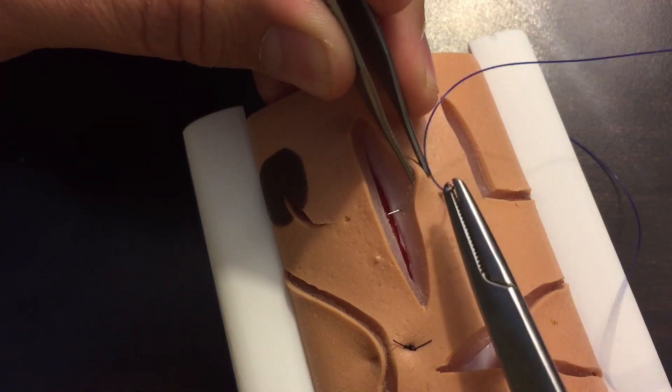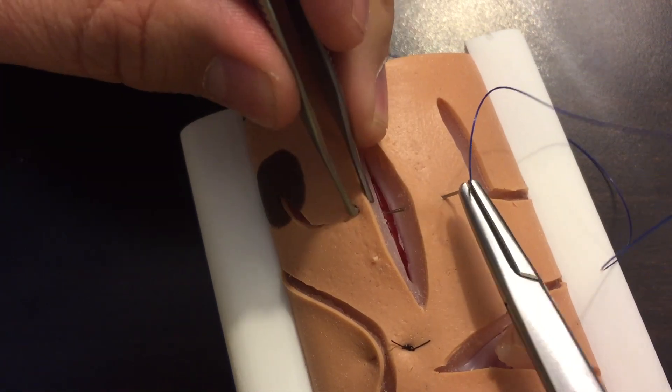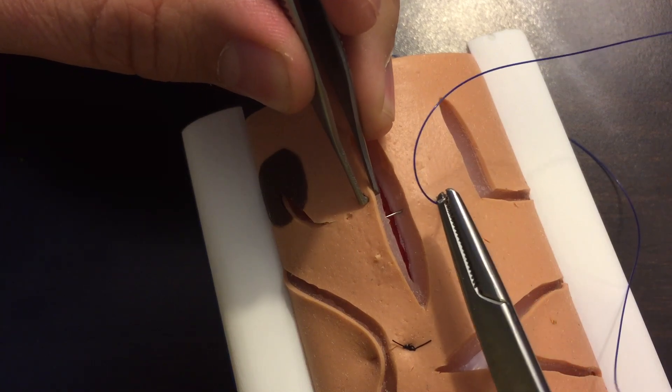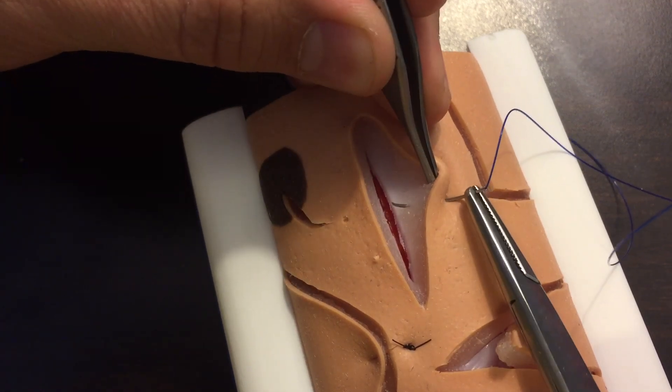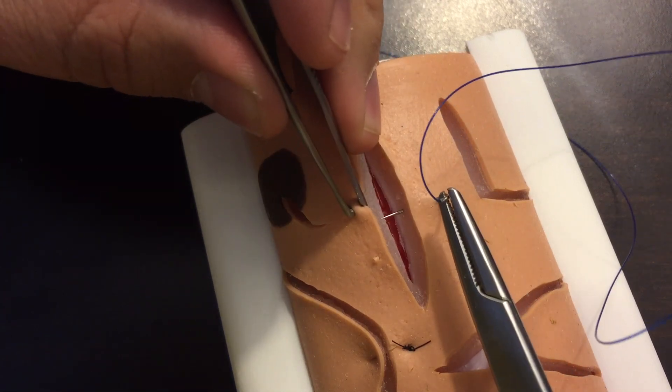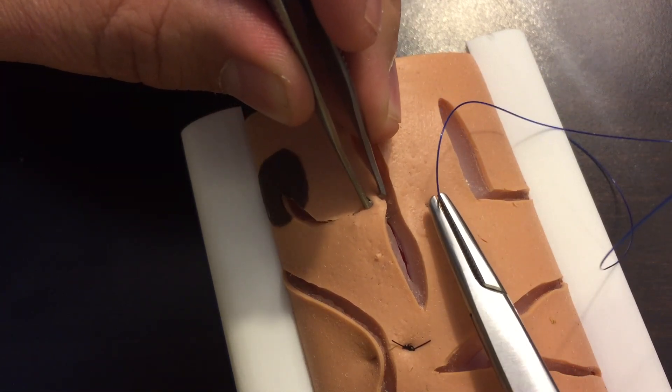You're going to come out, rotate it down, just like this. Then we're going to enter the opposite subcutaneous tissue at the same depth that we exited here. That's important, otherwise your skin is going to bunch up.